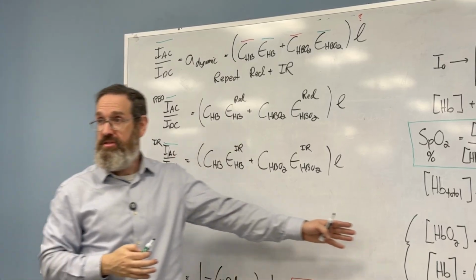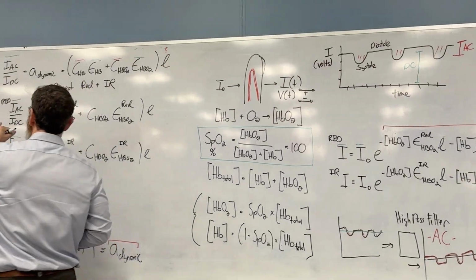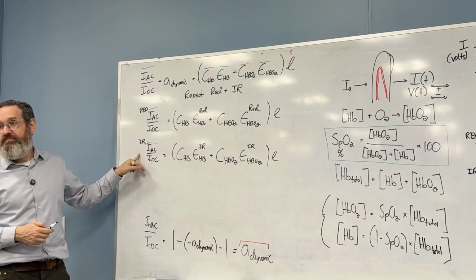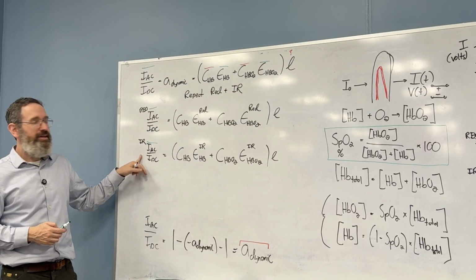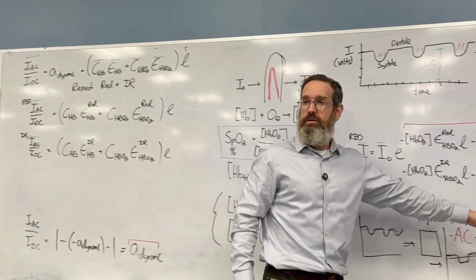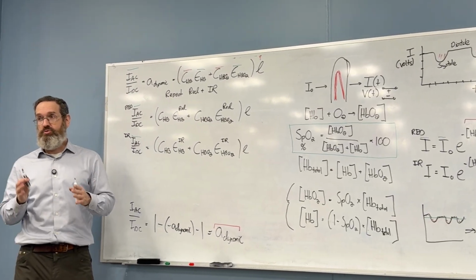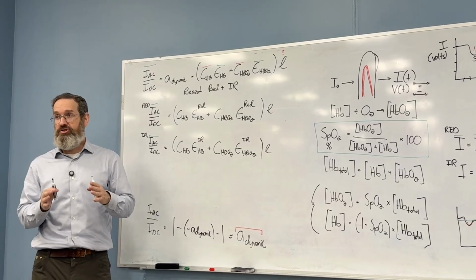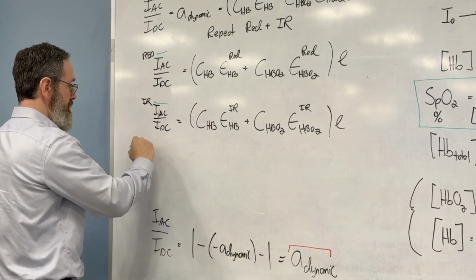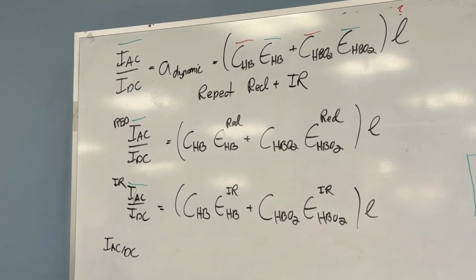I know that we did a lot of steps here, right? But just remember: high pass, low pass, divide it up, do it twice. So now you have the number 3 and you have the number 1.5. Well, if I have 2 numbers, I could divide those numbers. I already did one division. I'm going to do another division. And this is the key to pulse oximeters. Pulse oximeters work by what's called a ratio of a ratio. Because now watch what happens. If I take, let's call it AC to DC, which one goes on top? Red.